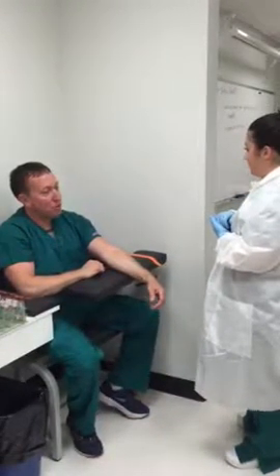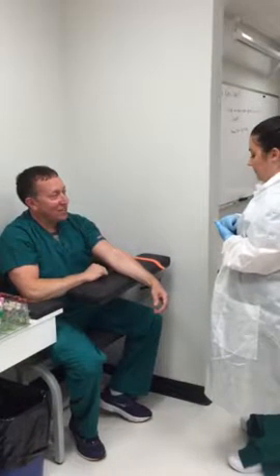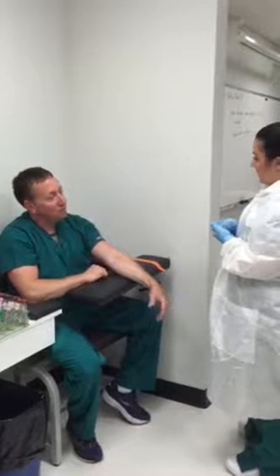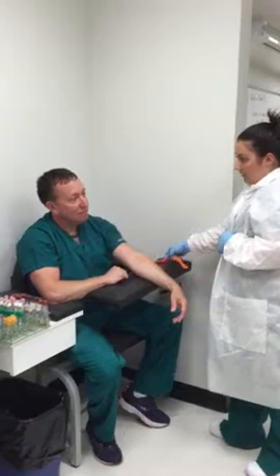Can you tell me your name and date of birth please? Sean O'Malley, 10-30-71. Do you have any allergies to latex? No. And have you had anything to eat or drink today? No, I fasted.